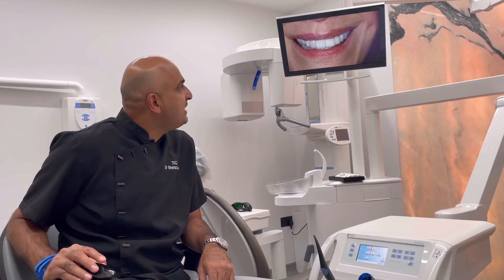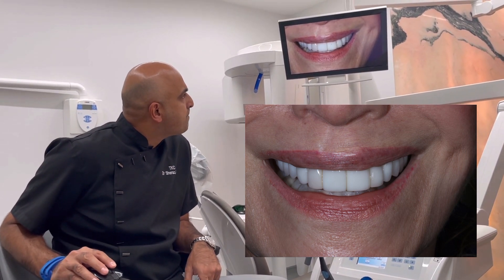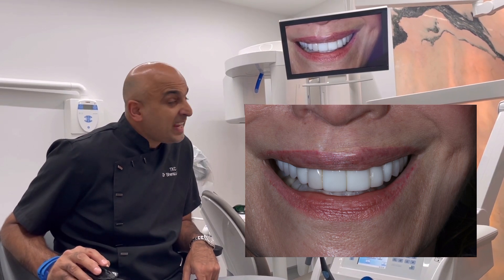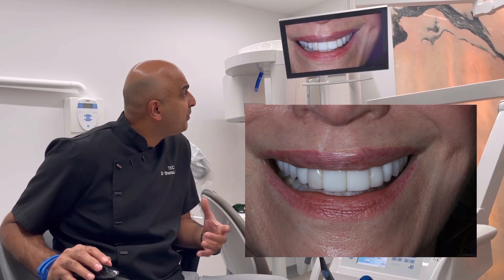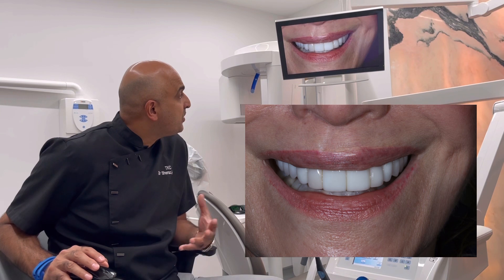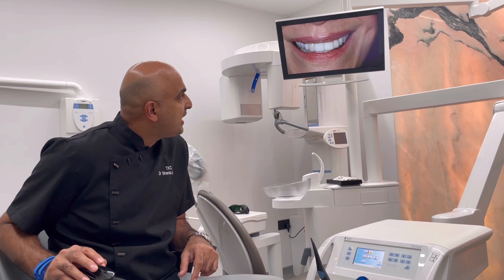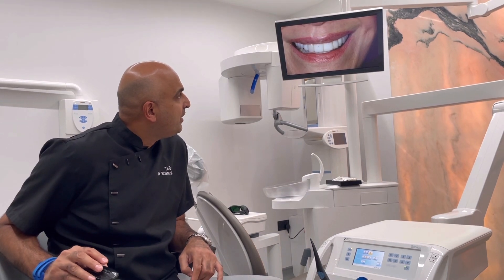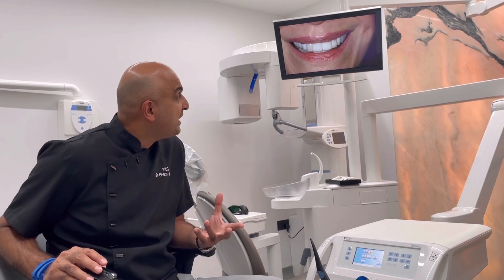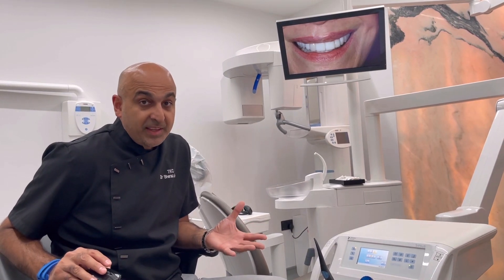This is a case that came in to see me sometime ago — I think last year actually. She came in with these veneers — she'd had 12 veneers done and they'd been in for 10 years. This lady is pretty well known in the beauty industry, so she doesn't want to show her face, which is understandable. As soon as I saw these old ceramics I thought, who did those? Because they just look like piano keys, as the term goes.